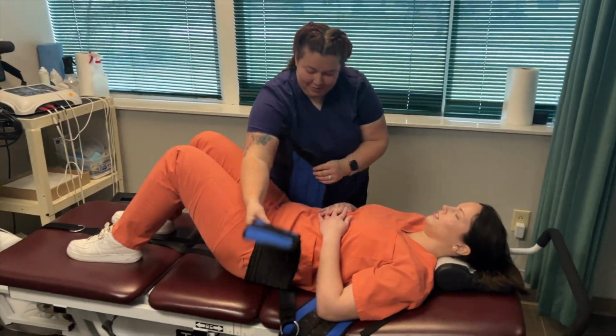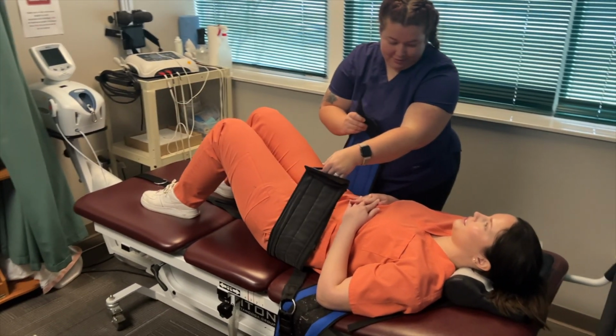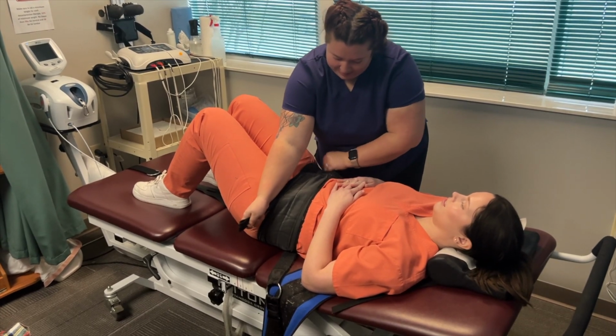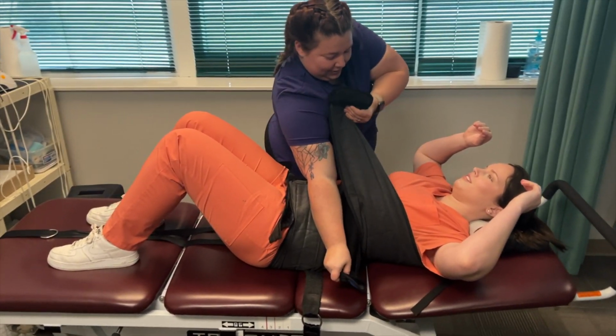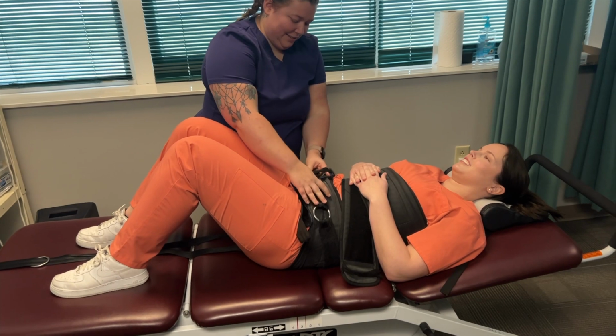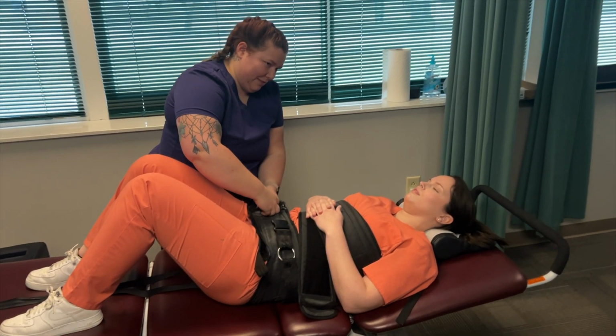Is there any pain or discomfort during the treatment? There can be. A lot of times when we're using this therapy due to the disc issue itself, people are in a lot of pain, or can be in a lot of pain. When we start to traction them out, we pay attention to their level of pain and the potential of spasm that's taking place in the spinal musculature. So we start out in a specific manner in the protocol where we ease the patient into it and make sure that they can handle these approaches before we get to the heavier pulls. There can be some soreness with it, but most of the time patients do really well.